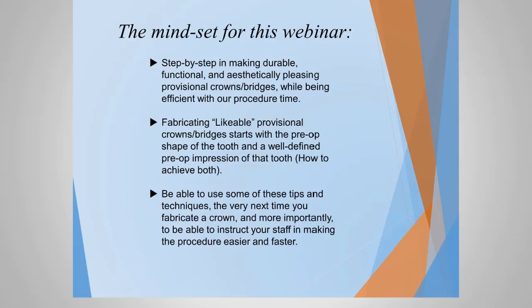The mindset that I want you to have for this webinar is I'm going to take you step by step in making durable, functional temporaries that, more importantly, you can make and be efficient with your time with these procedures. I also like to make likable provisional restorations, and that starts with making good pre-op shapes of the teeth that we're going to be preparing for temporary crowns and bridges, and also making well-defined pre-op impressions of those same teeth.